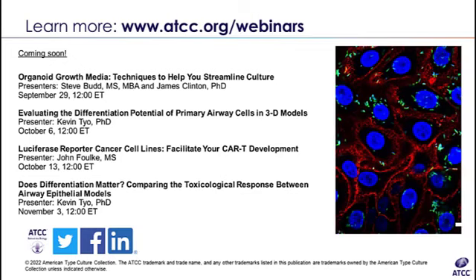And extremely basic or extremely acidic media is not going to be great for cell growth. As far as things like change in cell shape and behavior, that's a little broad. That's hard to say. You might definitely be seeing some cells detaching or apoptosing from the stresses caused by lack of CO2 for an extended period of time.